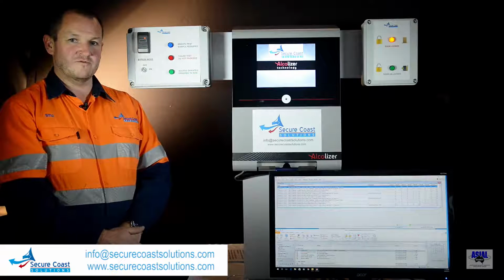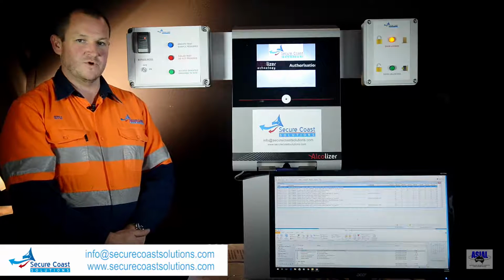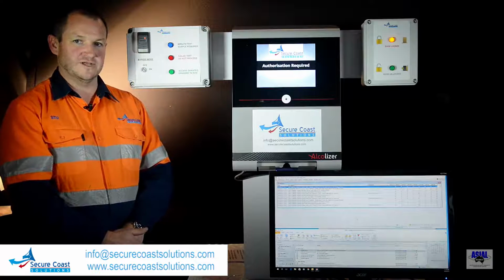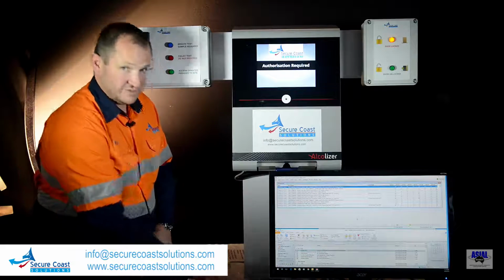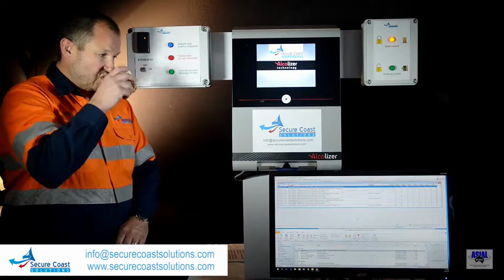Now normally before providing a breathalyzer sample, you would wait for at least 20 minutes after your last drink. But today, I'm going to have a sip of alcohol just to demonstrate a positive test result.